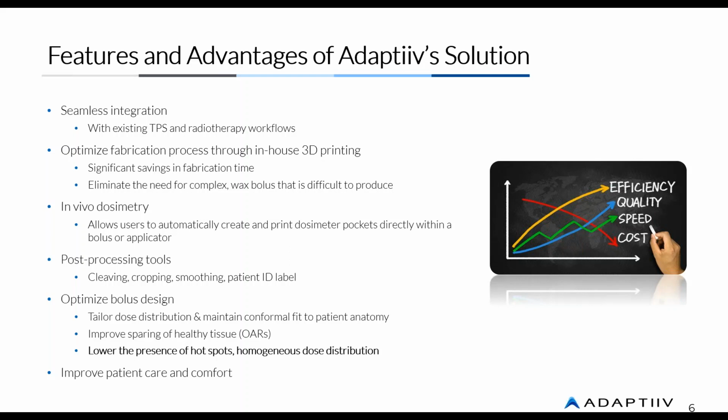And at the end, we have a brachytherapy module where we actually design a surface brachytherapy applicator, and we're designing catheter tunnels that are offset with a constant standoff and with a constant intertrajectory distance on a curved surface of the patient. So we're actually 3D printing the superficial brachytherapy applicator.